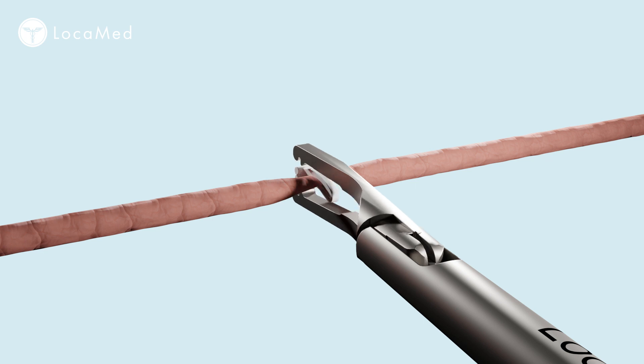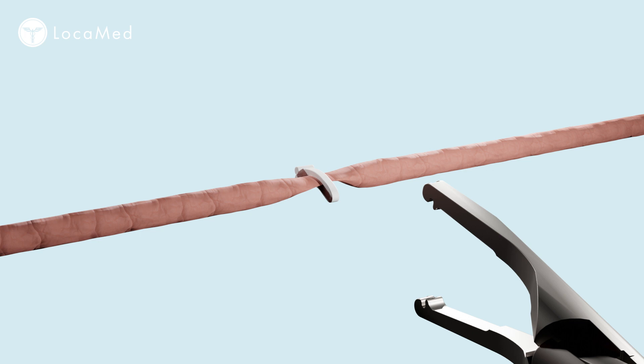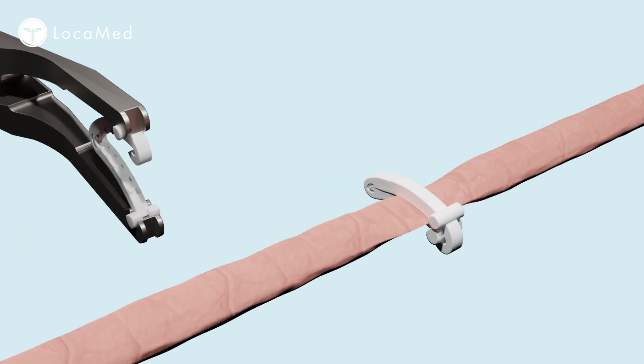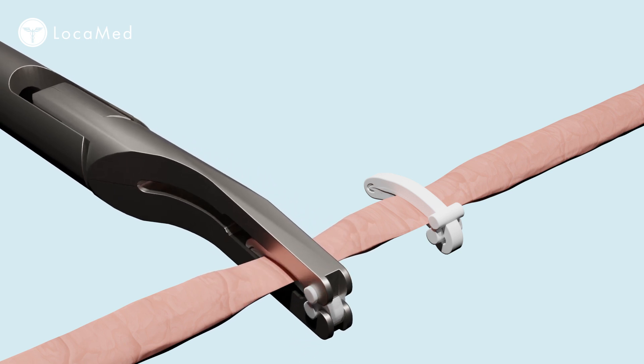Release the jaws and carefully remove the applier. Visually inspect the deployed clip to confirm satisfactory placement and closure of the clip. When deploying multiple clips, take care to ensure that clips are not placed in contact with each other and are not overlapping.